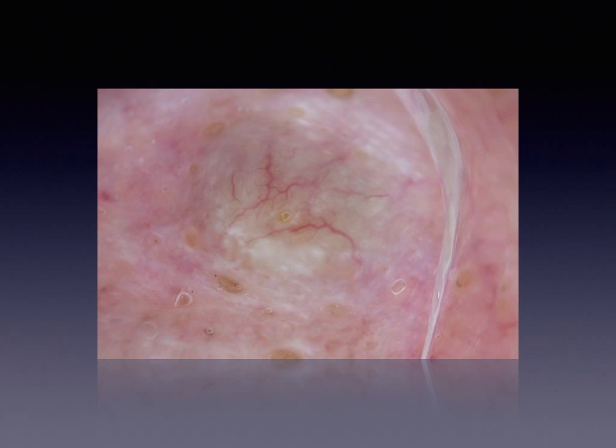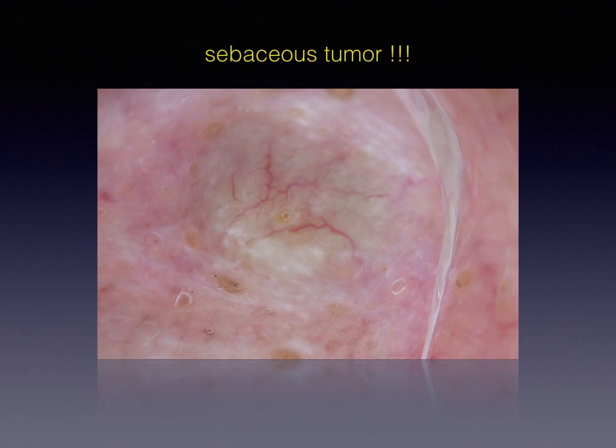In contrast to the pigmented structures, linear or arborizing vessels of BCC are not specific for the diagnosis, since they can be seen also in other tumors, especially of adnexal origin, such as this sebaceous tumor.